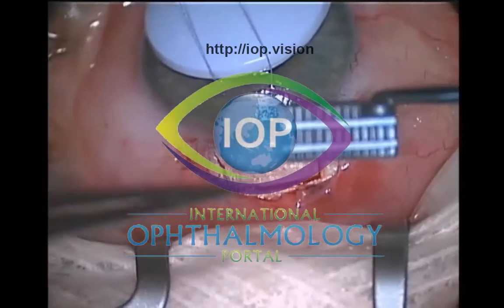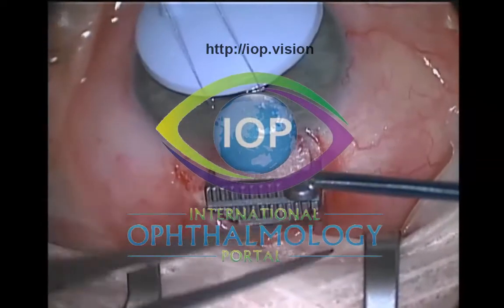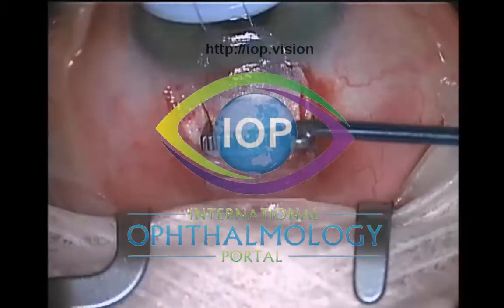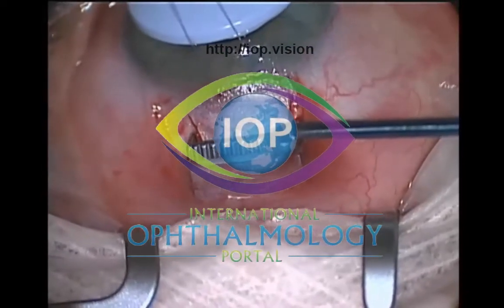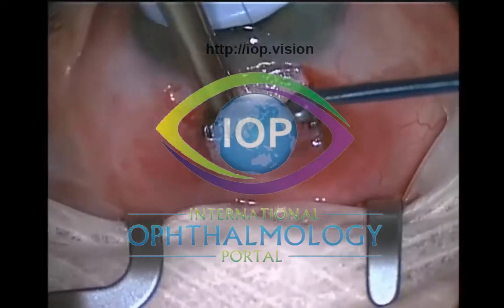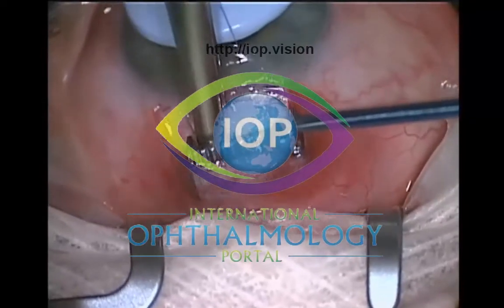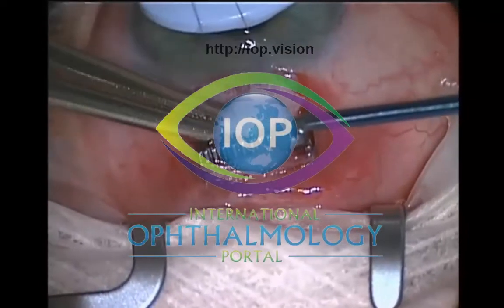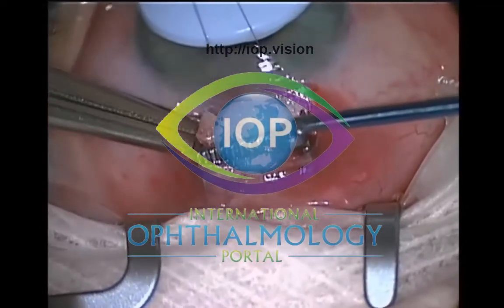Okay, so the next step is another modification I've done over the years, and this is a conjunctival retractor that I developed with Weiss. The idea of the conjunctival retractor is that it doesn't clamp the tissues. I know Peng Core has developed the core clamp, the conjunctival clamp, and that was designed to be as atraumatic as possible. But I found the clamp itself is quite tight, and it was actually crushing the tissue between the clamp, even though it was over a small area.